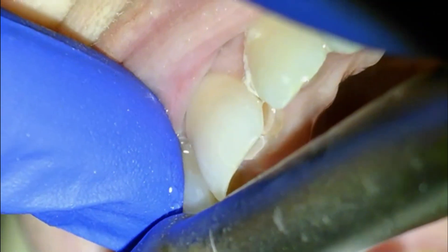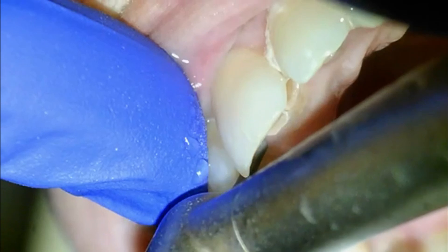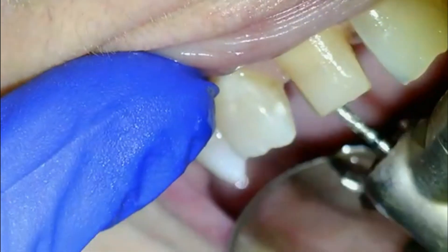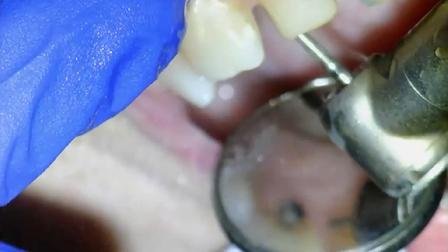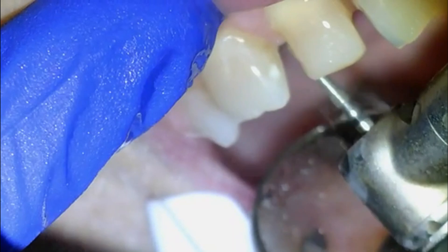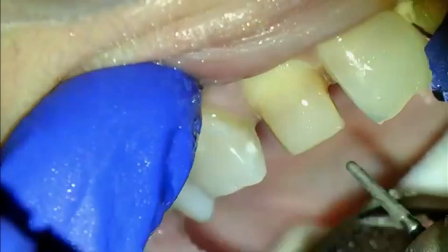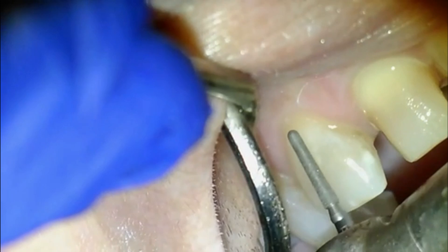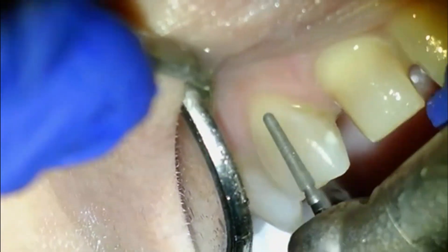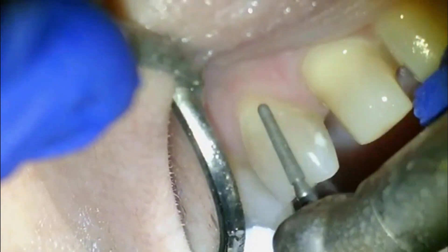Here you can see the backs of these teeth, how worn down they are. I'm working with this camera for only the second time, and the focus depth is such that even if I move one or two teeth back, it's kind of out of focus. I'll take that into account in later videos. The patient isn't really excited to be there and it's a long appointment, so I really didn't want to fiddle with making sure we were in focus every single time, and I don't like touching my loops when my gloves are dirty. In later videos I'll try to stick to one tooth or one area to always remain in focus.